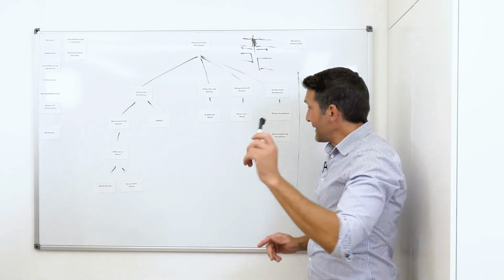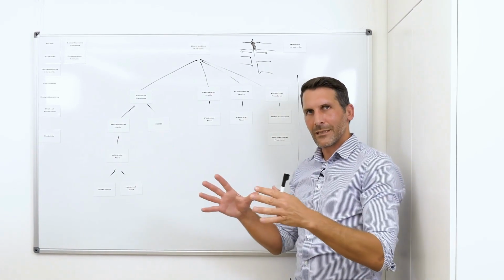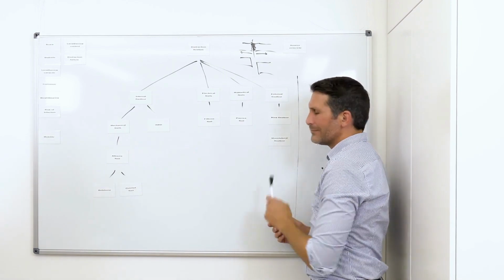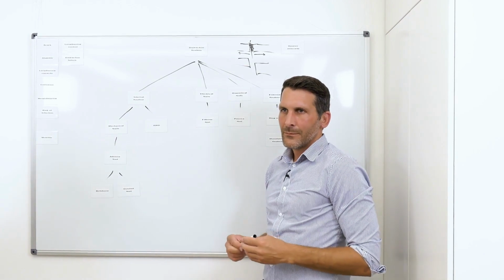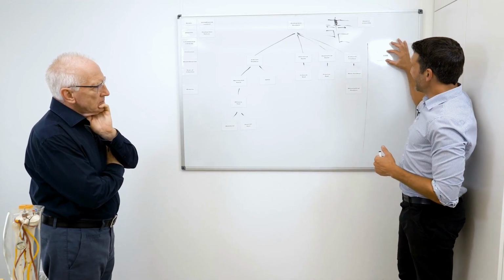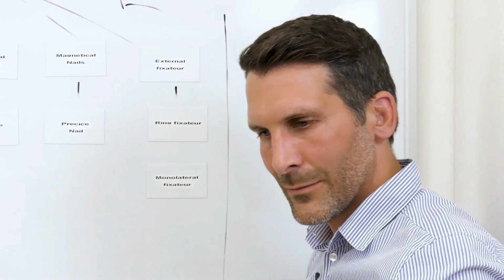I'll go over the external fixator again. We either have a ring fixator, which manages to provide stabilization in all three planes. Another variant of the external fixator is the unilateral fixator. The unilateral fixator takes a bit of a special position, especially when we talk about a so-called hybrid, namely LON. That means lengthening over nail, lengthening over a nail.